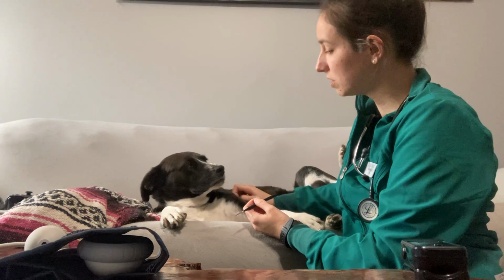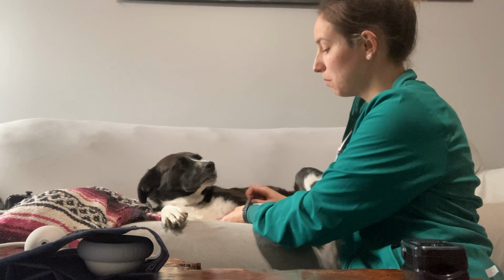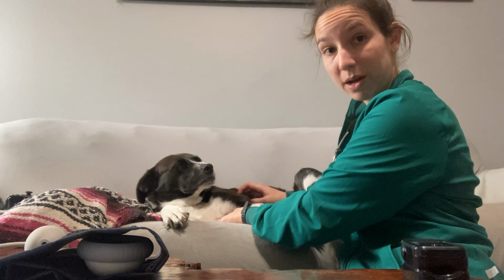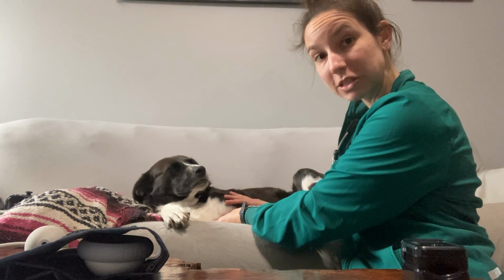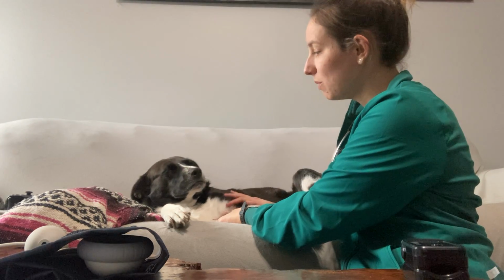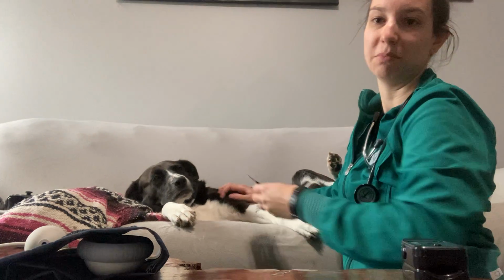As a further alternative though, I can also take an axillary temperature, sliding that thermometer probe at least halfway up there into the axilla and making sure that we hold a little bit of pressure so it's in there nice and snugly, and we can get an axillary temperature reading, keeping in mind that there might be up to a 1-degree difference between this and oral and a rectal temp. Hi, Sadie baby. She's such a trooper.